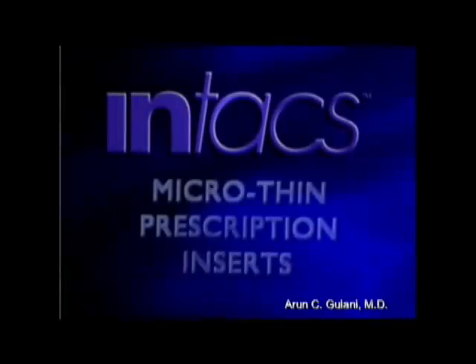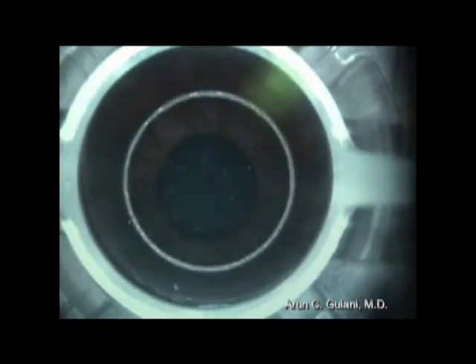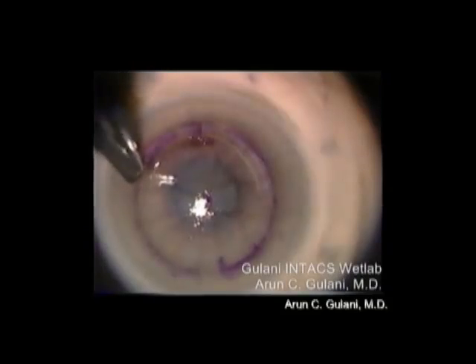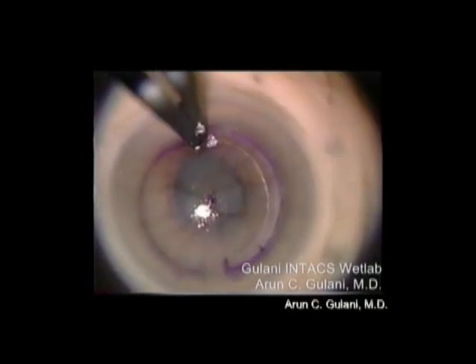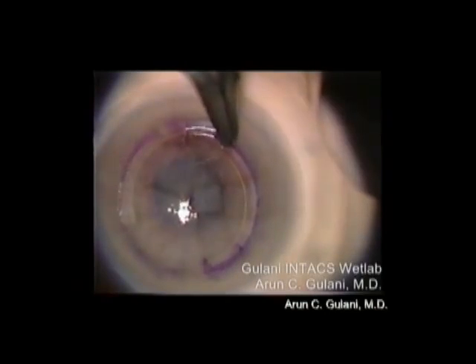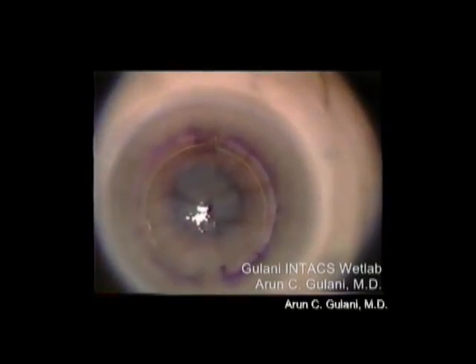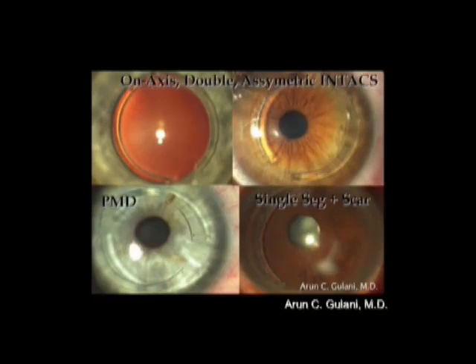In further ectasia, we can use Intacs by first making a channel in the lamellar cornea with a tiny slit incision. The Intacs rings can be inserted as segments — one segment — and they act by flattening the cone into a dome as you see here. The second ring is now being inserted. Intacs can be placed in various combinations of single or double rings, with large and small optical zones, for effective outcomes.